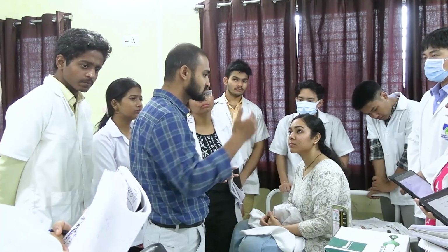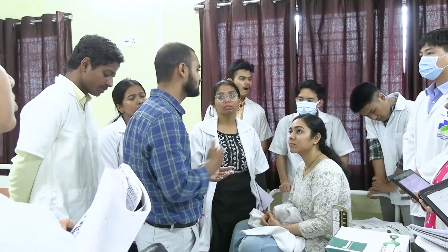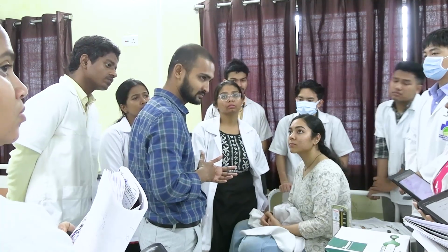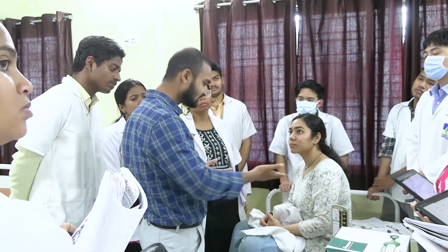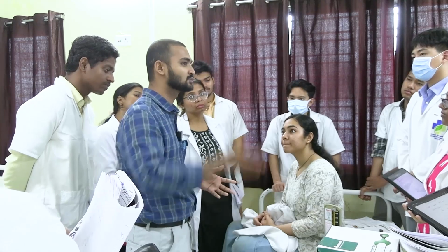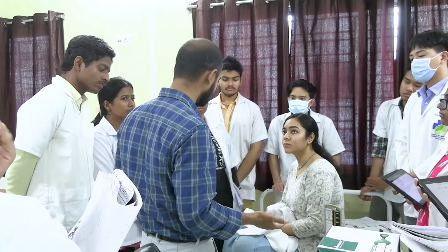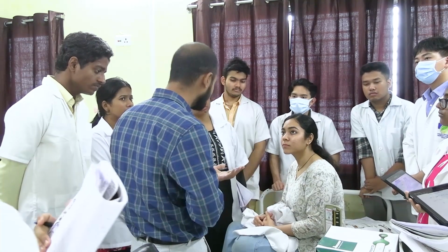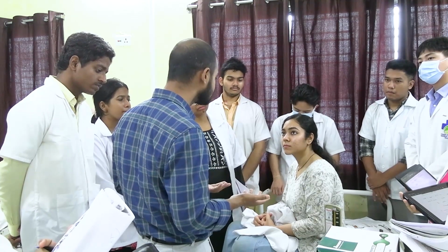The various phases. So suppose you thought his BP is 250, but when it goes down, suppose his diastole came around 140, but actually it is not. It is much higher. The maximum it is 300. So for every patient you cannot go till 300, isn't it? So this is helping us indirectly. First you have to go for the palpatory method, then the auscultatory method. This is the advantage. What about disadvantage?